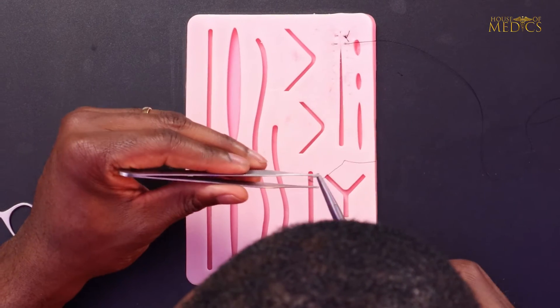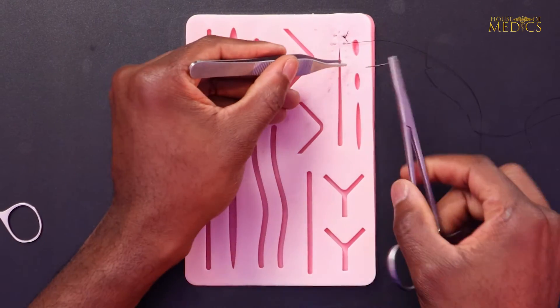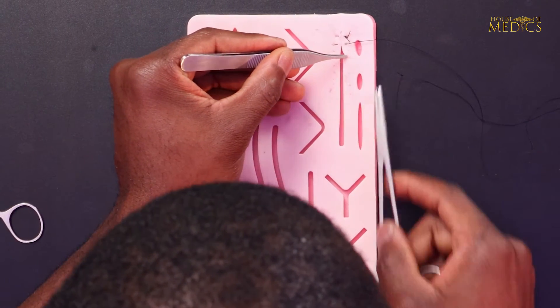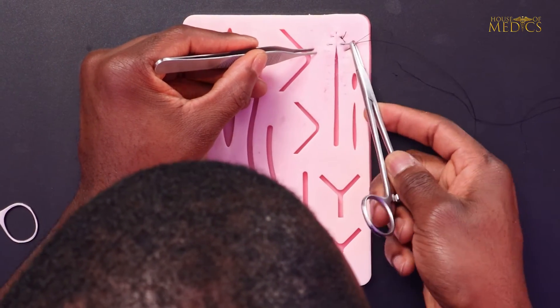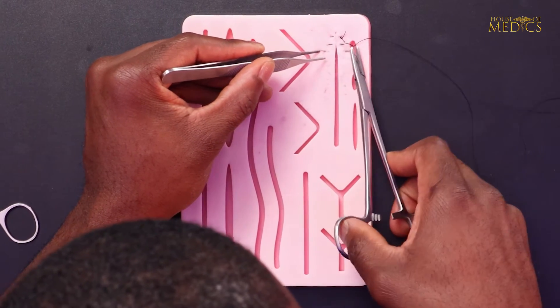You continue your running vertical mattress suture by passing another far-far throw along the wound, in this case more proximal towards this end of the wound. Once you get more comfortable, you can feel free to pass your far throws in one movement.